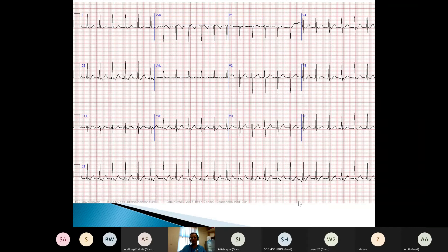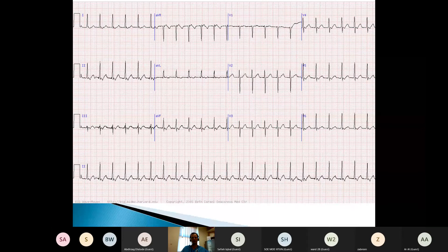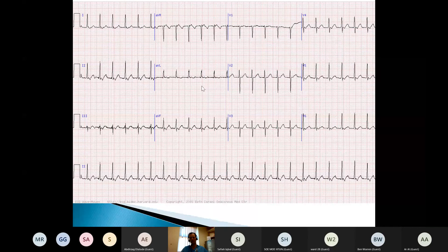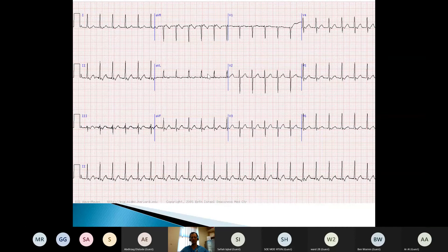Can anybody suggest anything else? Can they see anything else in this ECG? We could obviously have atrial fibrillation. Ben has suggested a junctional or an AVNRT. You can have a junctional tachycardia — that's relatively rare, we normally just get a junctional rhythm. But we can certainly have an AVNRT. So what points us towards an AVNRT rather than fast AF or atrial flutter or something else?